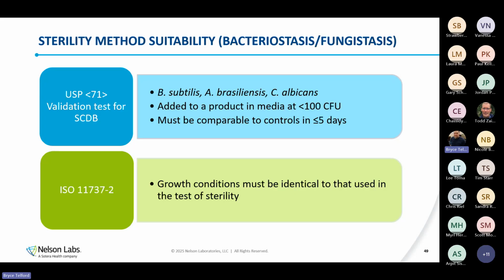One of the things that's kind of nice is there actually is a caveat within the standard that if I cannot dilute it and get acceptable results, if I cannot neutralize it and get acceptable results, then I minimize the effects as much as possible and I can proceed with testing. Now, the key here is, yes, I need to minimize the effects as much as possible.